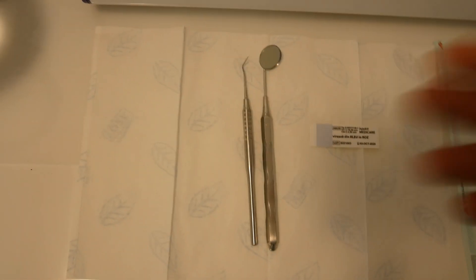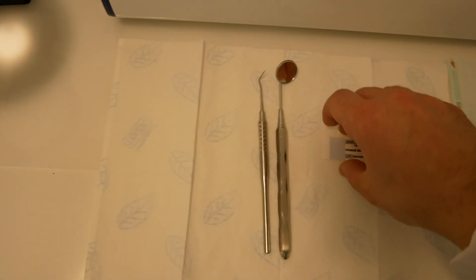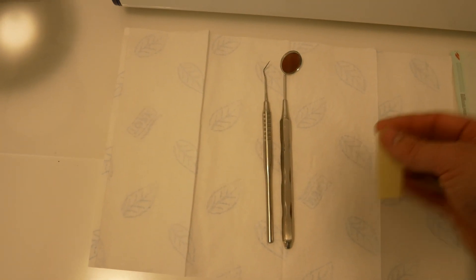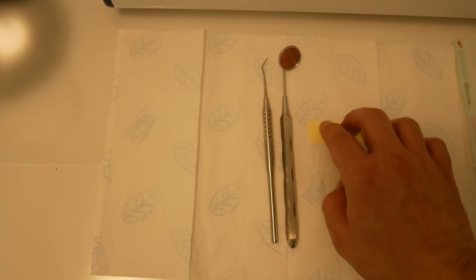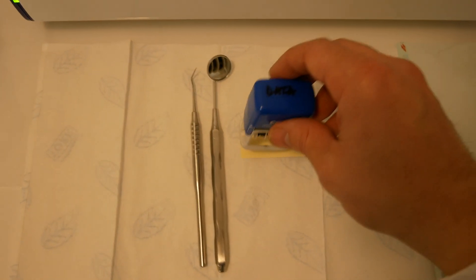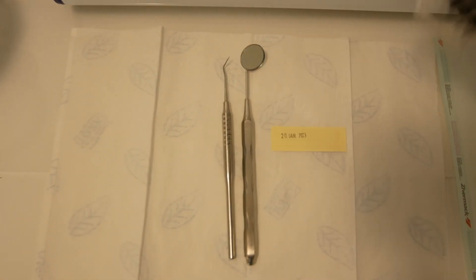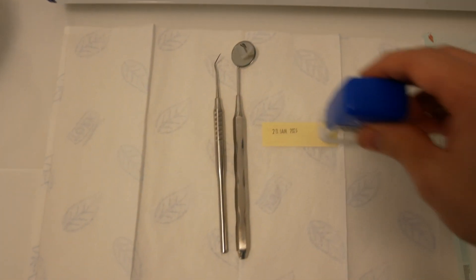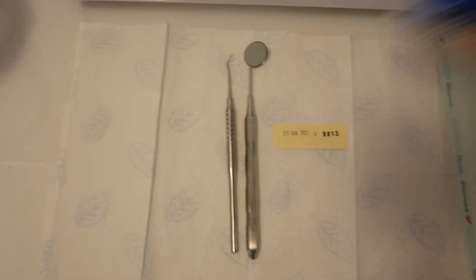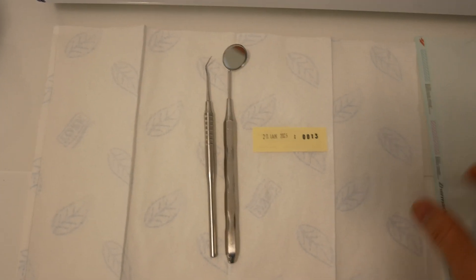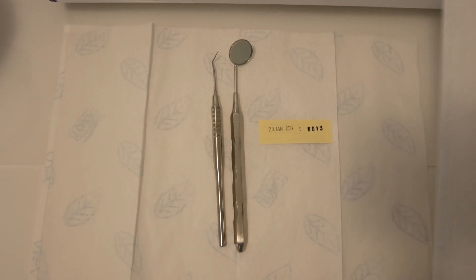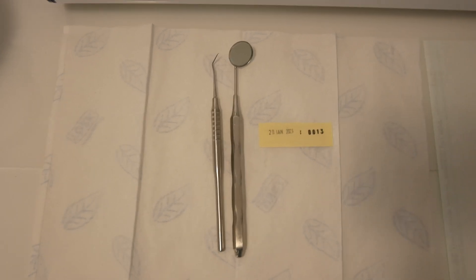Also, for traceability purposes, I'm stamping the date and also the packaging lot on each of the class 5 integrated strips and also on the package itself.